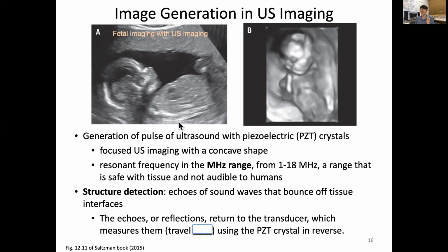There are various ways, but one typical one is piezoelectric crystals. As I told you before, piezo means pressure generates electricity. On the other hand, when you give electricity or voltage changes, that will generate a different movement of the PZT surface that will generate a pressure wave, which is ultrasound frequency right now.